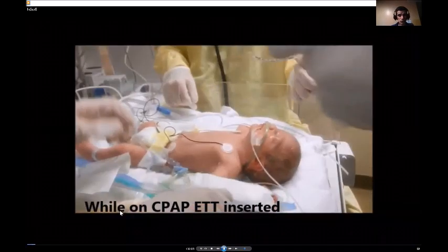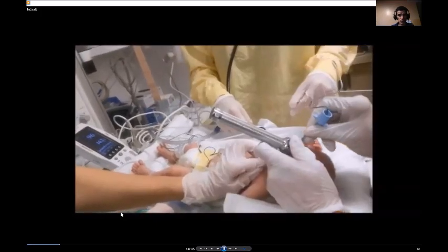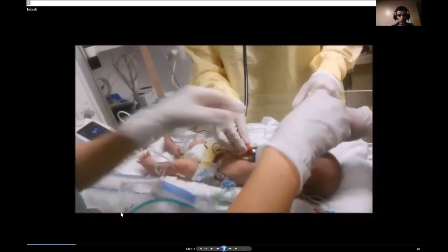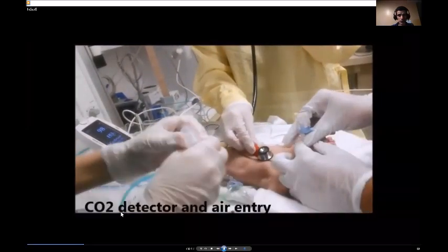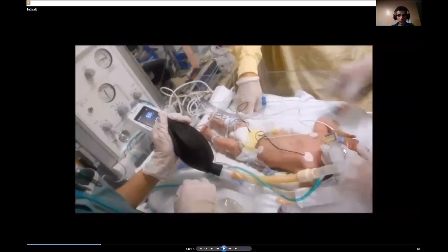You can start the process by inserting the blade of the laryngoscope, then catheterizing the trachea with the ETT, removing the stylet, and then connecting the CO2 detector to accurately assess tracheal catheterization, also auscultating both sides.